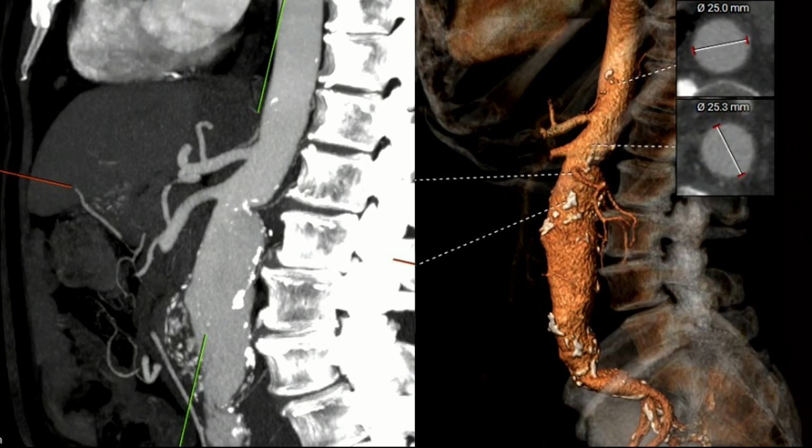This is the sagittal view, so looking at it from the side, you can see the aneurysm actually goes all the way up to our superior mesenteric artery. And then there's this kink here. This kink causes angulation, and my concern is that the graft would cause an endoleak channel if we didn't include the celiac artery as well.